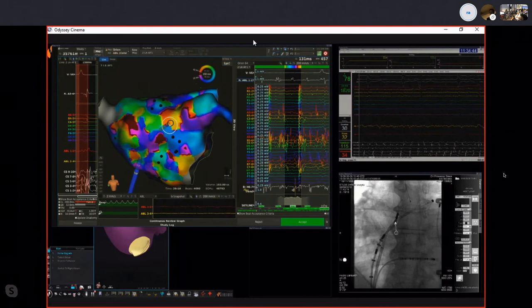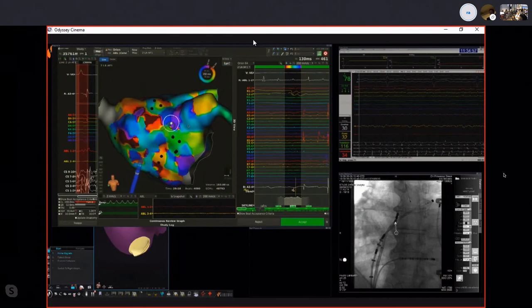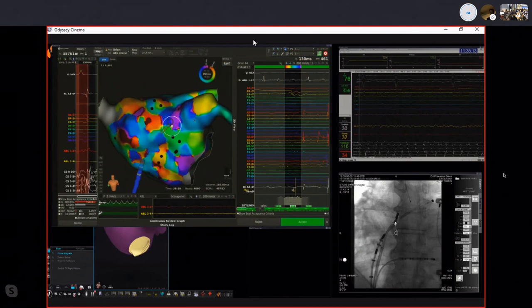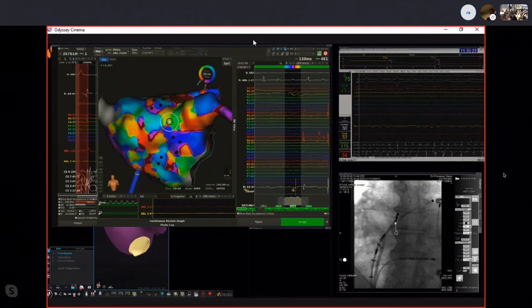Are you still hearing me? We hear you, but it's partially, intermittently, not so. Oh, I'm sorry for that. So did you hear that I was focusing your attention on this spot where activation mapping is suggesting that we might have a predominantly rotating activation pattern around the central point? Yes, we can recognize that, albeit my eyes are telling me there are about six or seven of such areas. No, of course, but let's focus on this one first, okay?